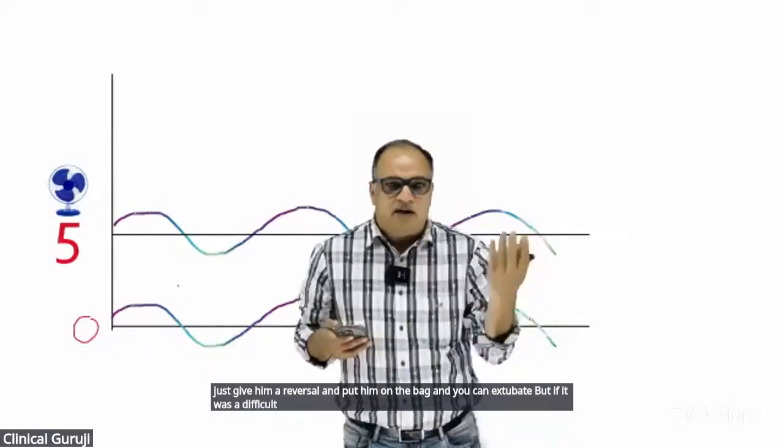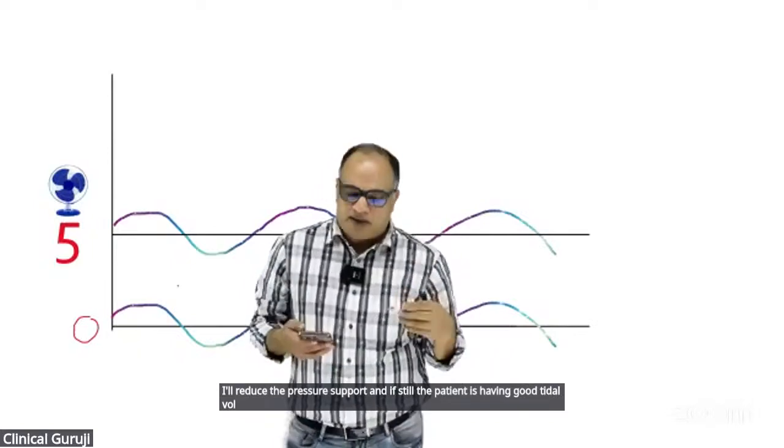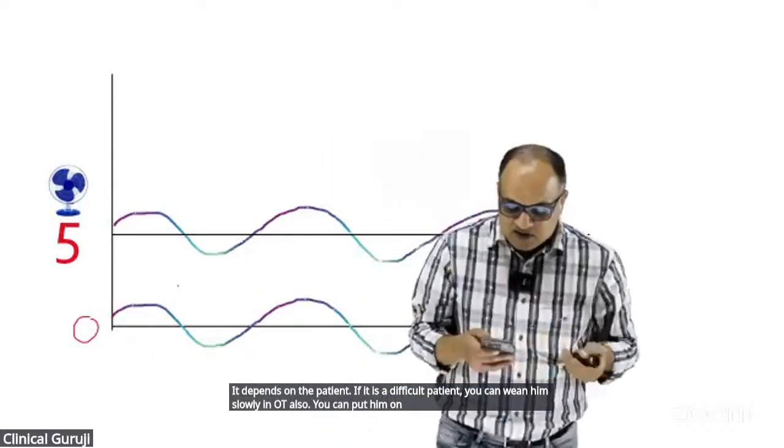But if it was a difficult patient, I used to conduct bariatric surgeries. I will put a patient on SIMV plus PSV in OT also, then pure PSV in OT also, then I'll reduce the pressure support, and if the patient is still having good tidal volumes, only then I'll extubate. So it depends on the patient. If it is a difficult patient, you can wean him slowly in OT also. You can put him on PSV, non-invasive ventilation.